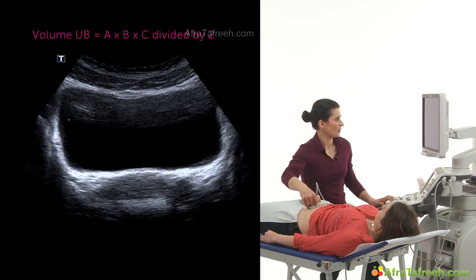We got the transverse diameter from the right to the left side of the patient, which is 10 centimeters here. Sorry, take it again.